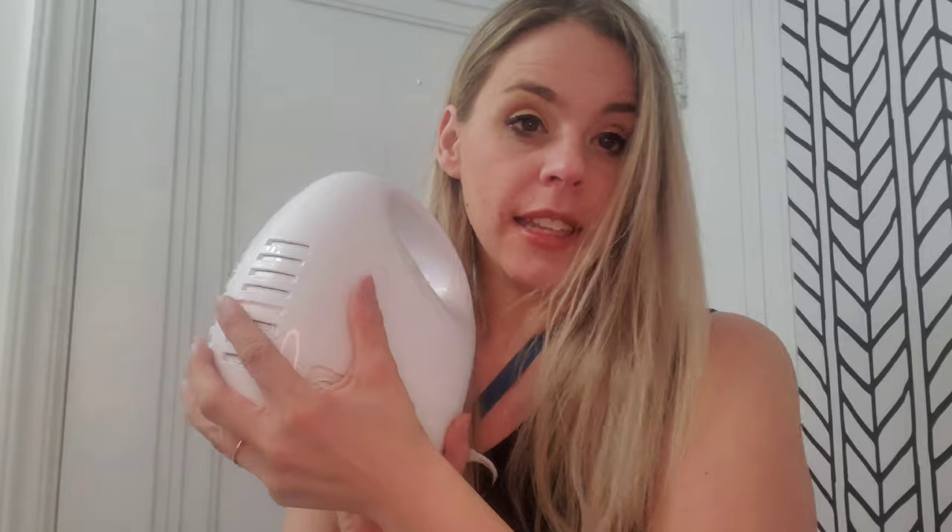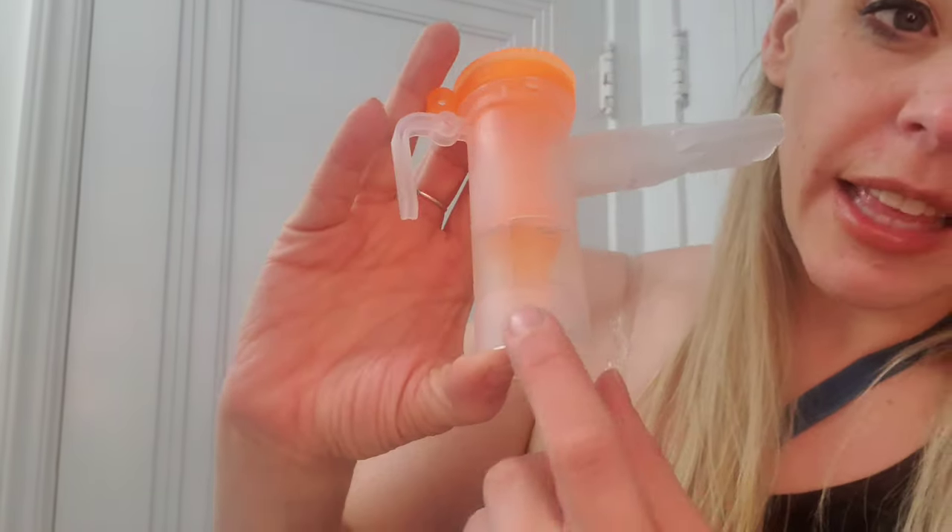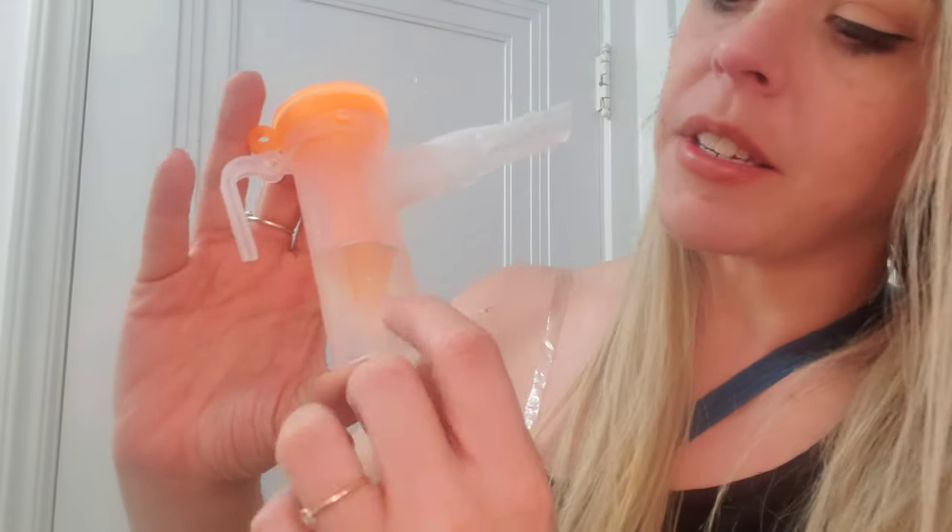It comes with everything you need. It comes with a power cord that attaches into the base, and then the actual nebulizer comes with the mouthpiece and the little reservoir. It also comes with a very clearly labeled side that lets you know exactly how many ounces of fluid to put in and what the max level is.